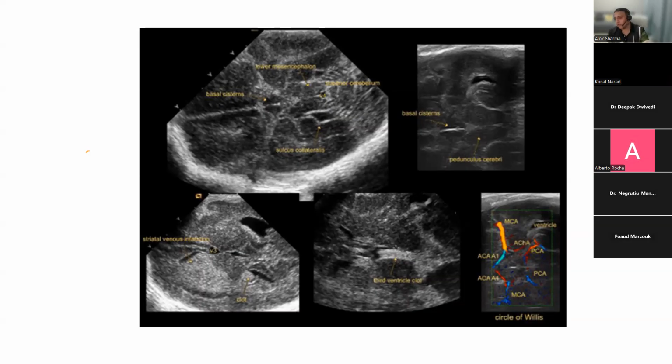Because what we've covered so far is basically basic physics. We've covered the anatomy twice, and we've covered the protocol. And by Thursday, I need you to be completely familiar with this. I need you to put a probe on. Even if you're not doing probe peer review, you can do individual peer review. We don't record. I just have a look at your images and help optimize them. I did that with 7 people for the lung ultrasound course. I'm very happy to dedicate time for you.